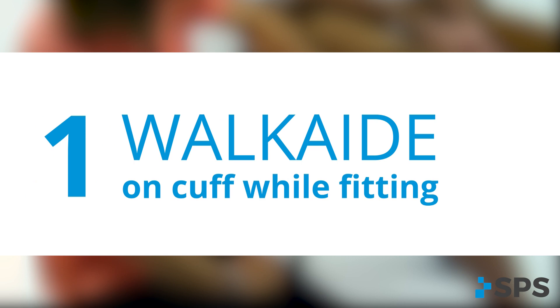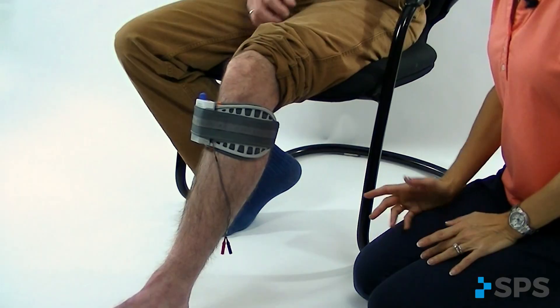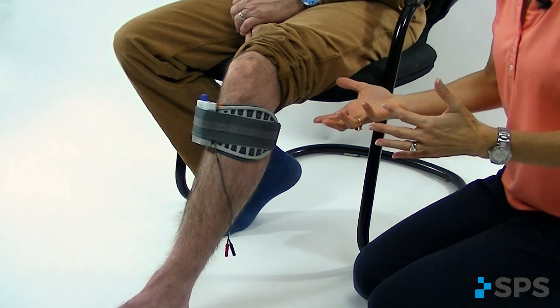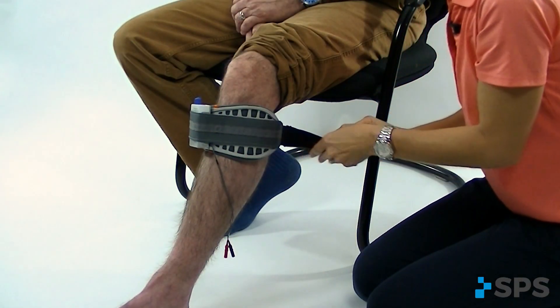Before you start placing the electrodes on your patient, make sure you put the WalkAid on the cuff so that it gets the actual size of the cuff that's going to be fit to the patient. In order to get reproducible outcomes in the clinic, and also for your patient to get reproducible outcomes at home, you want to make sure the cuff fits snugly. You can't have any gapping in between the skin and the cuff.